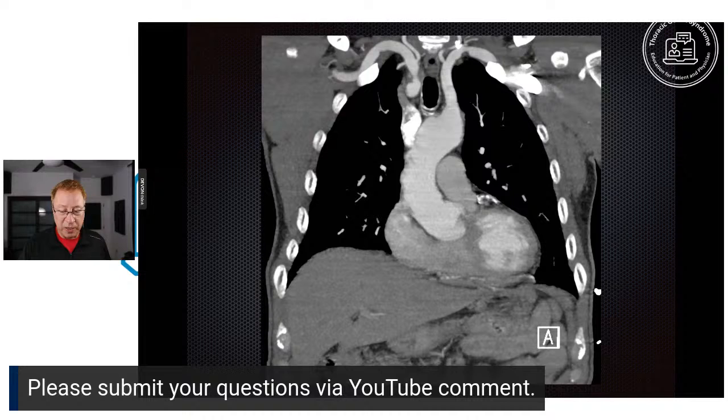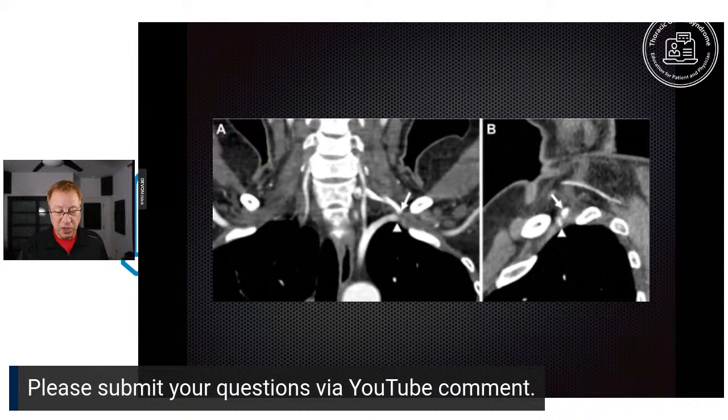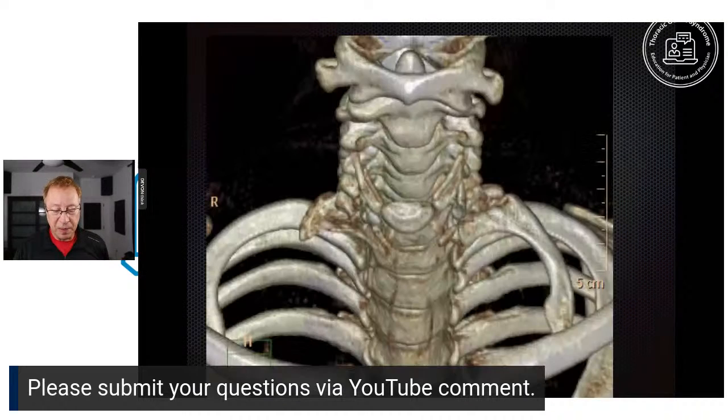But you'll also notice that the muscles on each side, the grayish things, are very hard to distinguish from one another. And you can't at all tell the nerves from the muscles. So here's another picture, just two pictures from the same area. You'll see again, very bright white bones. That's great. Very bright white arteries because you put contrast in them. But you can't see the muscles from the nerves, so you lose out on the soft tissues. See the blood vessels, but the rest of the soft tissues you can't tell apart.